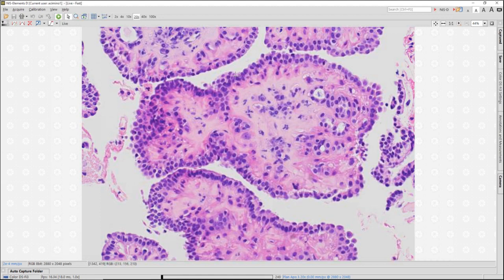It can take a variety of forms, kind of low cuboidal. It can undergo apocrine metaplasia. It can be columnar. It can have more abundant secretory type cytoplasm. So that can vary, but it should be normochromatic, non-atypical. And we'll have the second layer of myoepithelial cells that line these fibrovascular cores and the periphery.